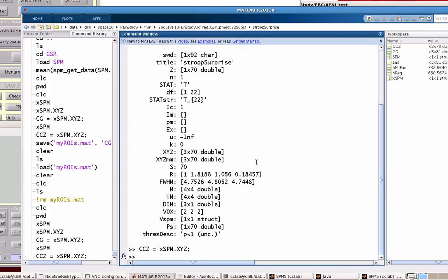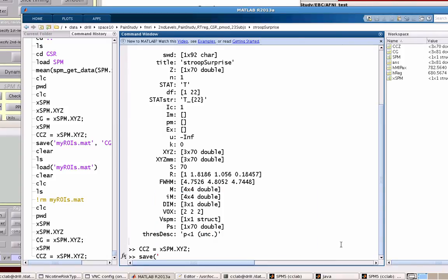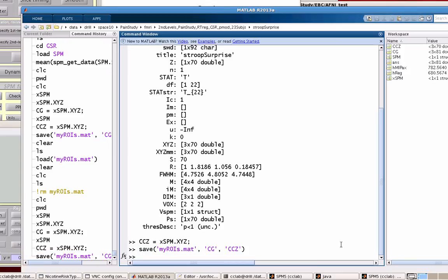And now I have two ROIs. Now if I want to have all of these for reference at a future date, I can just save my ROIs.mat with CG and CCZ.